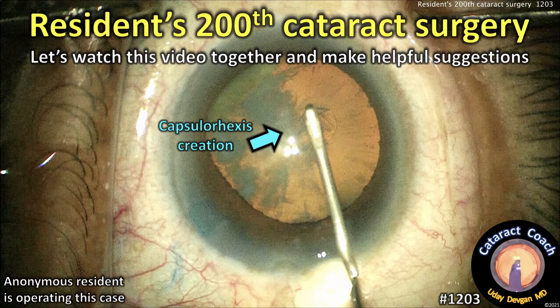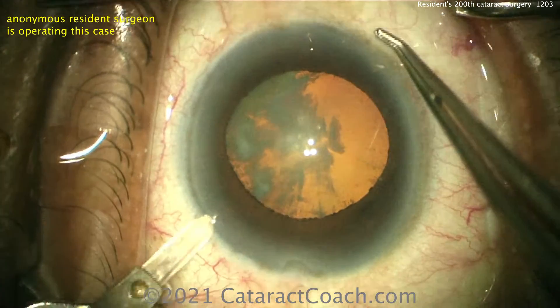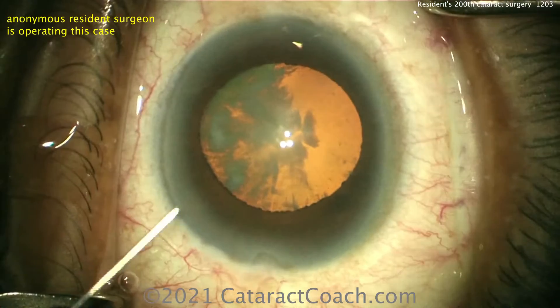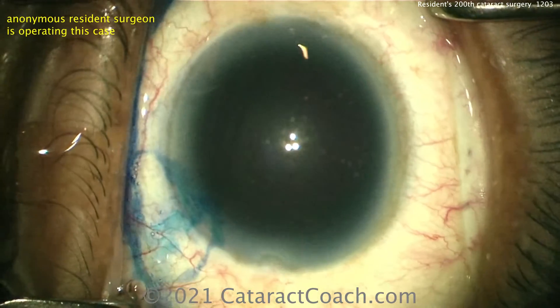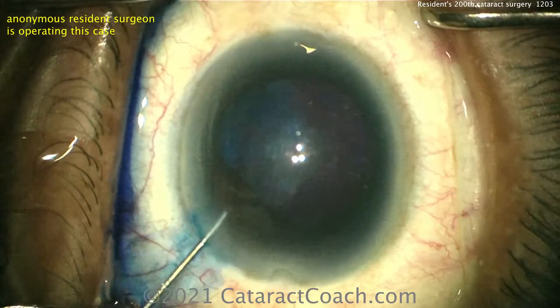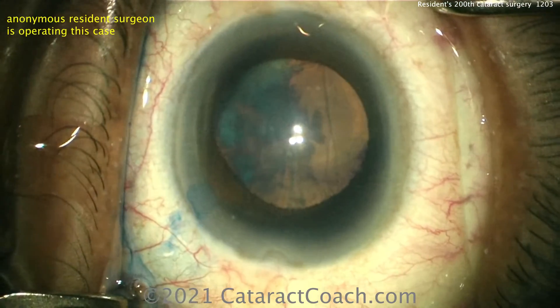cataractcoach.com — a resident's 200th cataract surgery. Let's watch this video together and make some helpful suggestions. Starting off with a diamond blade for a paracentesis — that's nice. It's a real cataract with a lot of cortical changes. Looks like some trypan blue dye, which is a good idea in this case, especially because there's a whole quadrant of cortical opacities that are going to block the view for the rhexis. Looks like diluting that down with either BSS or maybe some anesthetic.